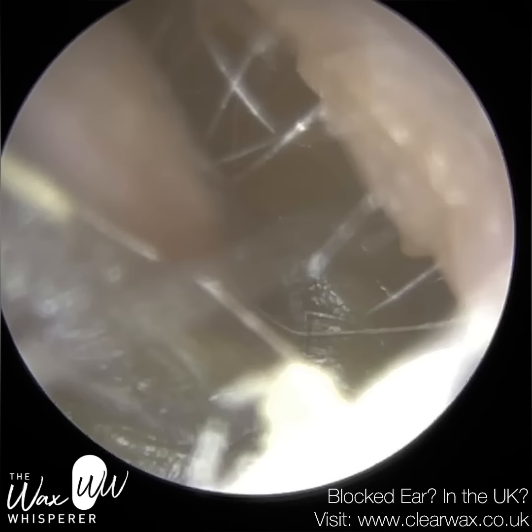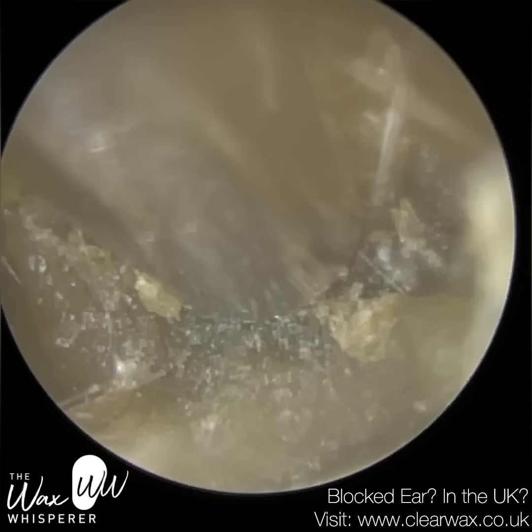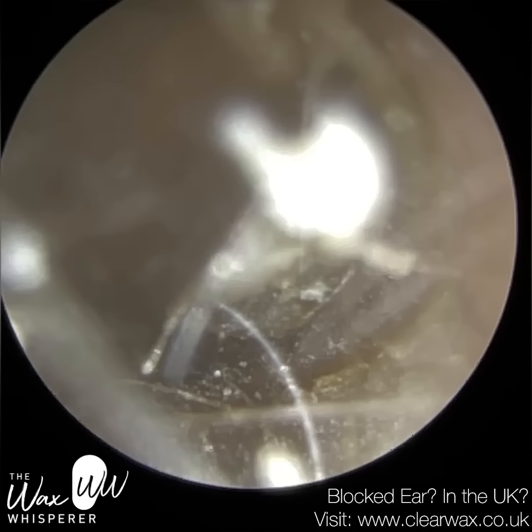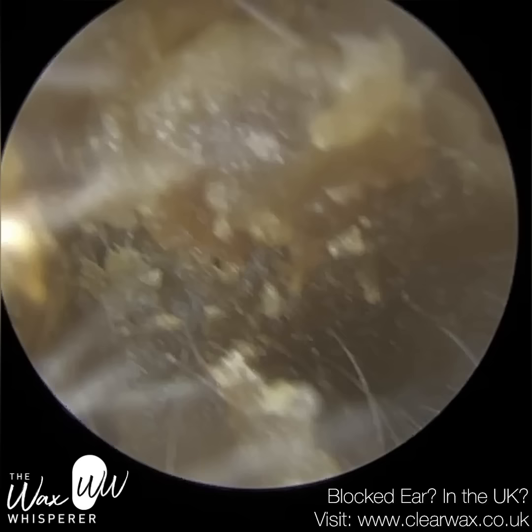We have here a patient who attended with bilateral blocked ears and I'm just commencing with their right ear. As you can see, this is full of dead skin as opposed to earwax. Sometimes it's difficult to distinguish the difference between earwax and dead skin keratin, partly because the majority of earwax is actually made up of dead skin — around 60%. But this plug is probably about 80 to 90% dead skin, so I would classify it as a keratin plug rather than an earwax plug.